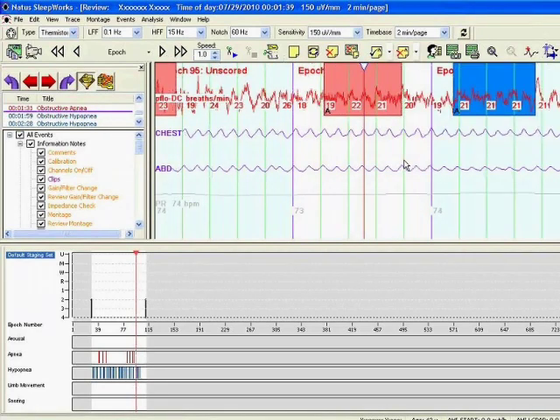So this example, I think, clearly demonstrates that even if you use a channel type that the analyzer is not designed to use, you can recreate a montage, add the same channel that you used for the recording, but in the montage change the channel type to reflect one of the channel types that you know the analyzers will look at.